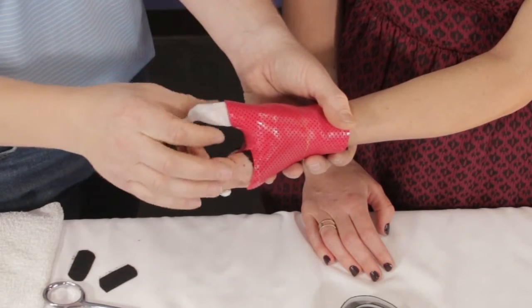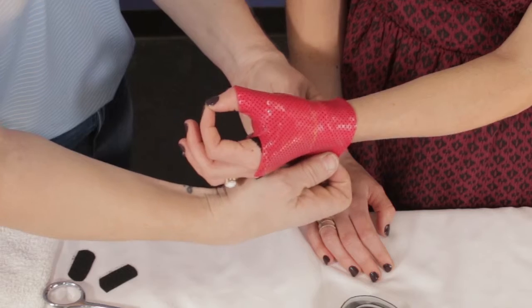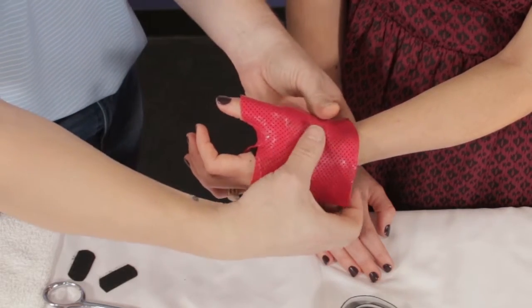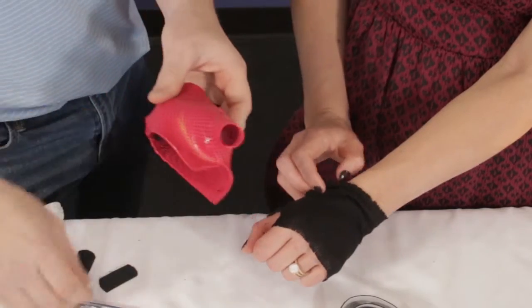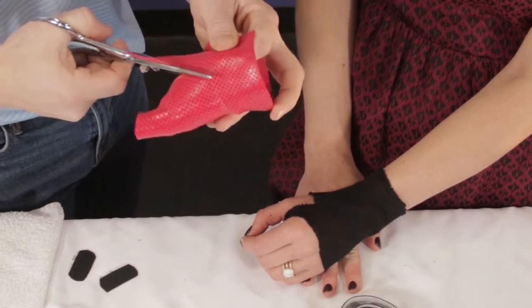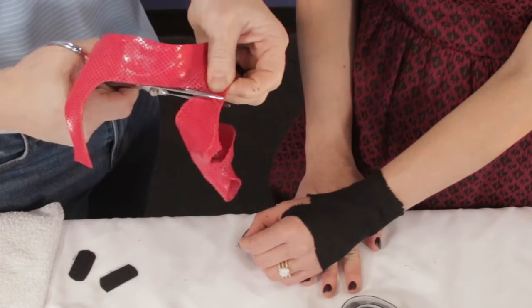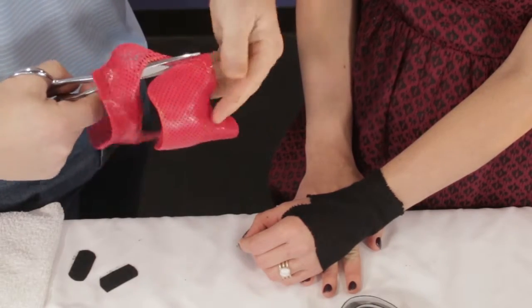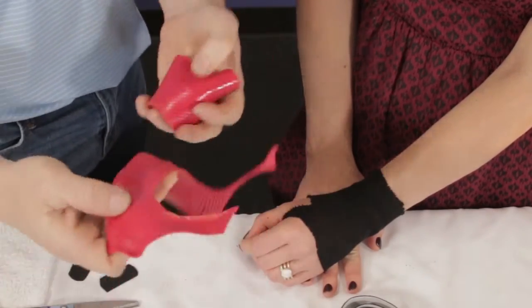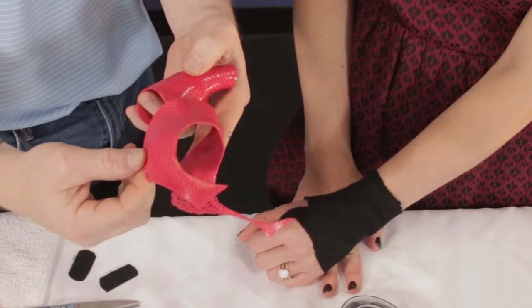To take it off, I'll break the seal. I'm going to untag this — if you get stuck, it can come off relatively easily and you just glue it back down with solvent. I like to cut it when it's maybe not completely hardened; if you wait too long, it gets harder and you're putting more stress on your hands, but cutting it now makes it a little easier. If you've forgotten to cut tags ahead of time, you can use the little cutoff pieces for your tags. That cutoff can also be saved for a finger splint — you can heat it back up and use it.